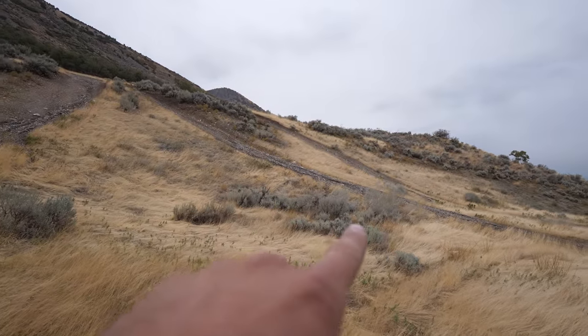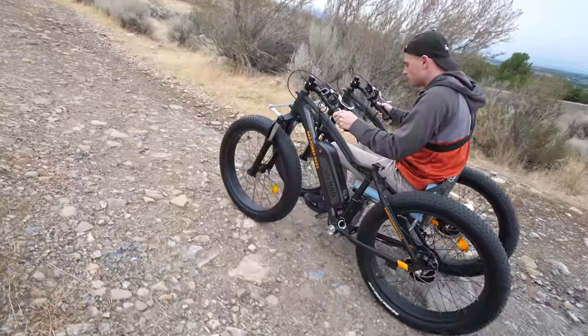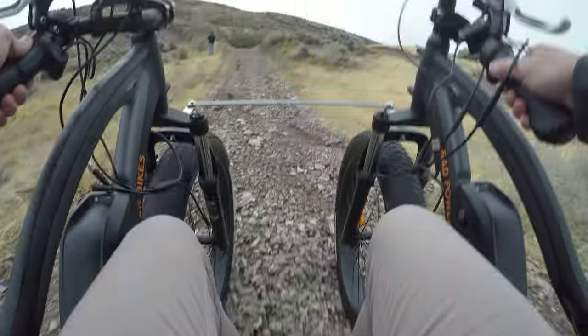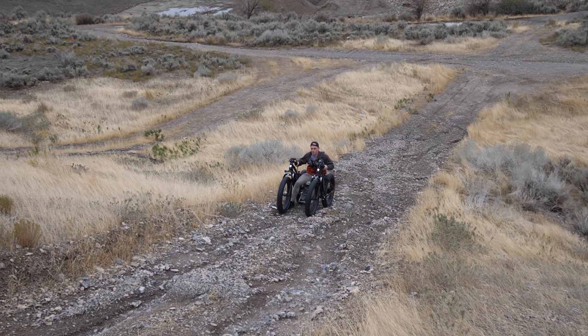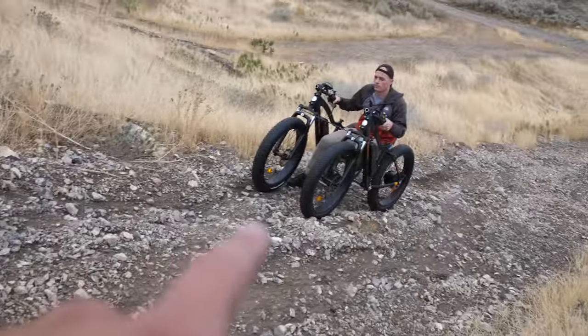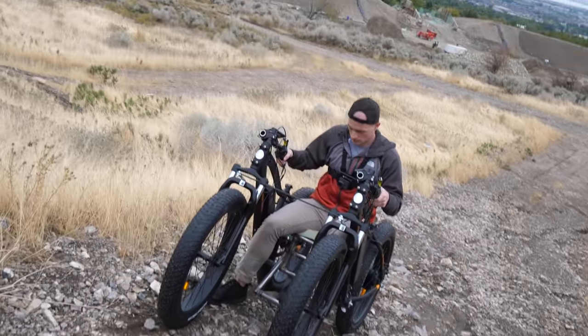Spencer's going to try this trail right here, which is gravel and pretty darn steep. There's a pretty deep rut on one side so we're staying over. Right here there's a lot of gravel and no traction, so I bet an asphalt trail would work better. Let's keep going on the trail.